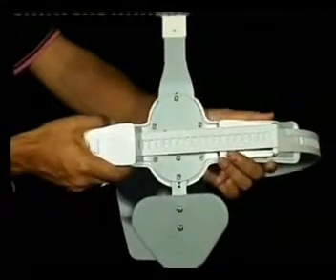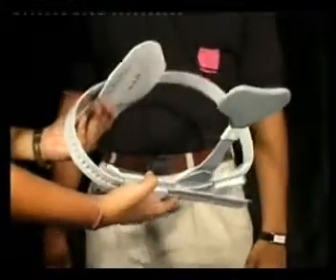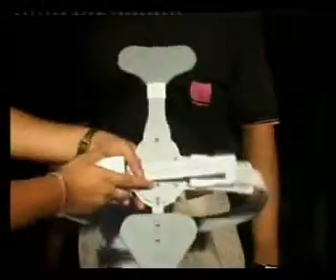It is also lightweight. This is also similar to the 4C as it has a ratchet closure. Depending on the small back pad or large back pad, you have to decide. The length of the torso is also adjustable here.